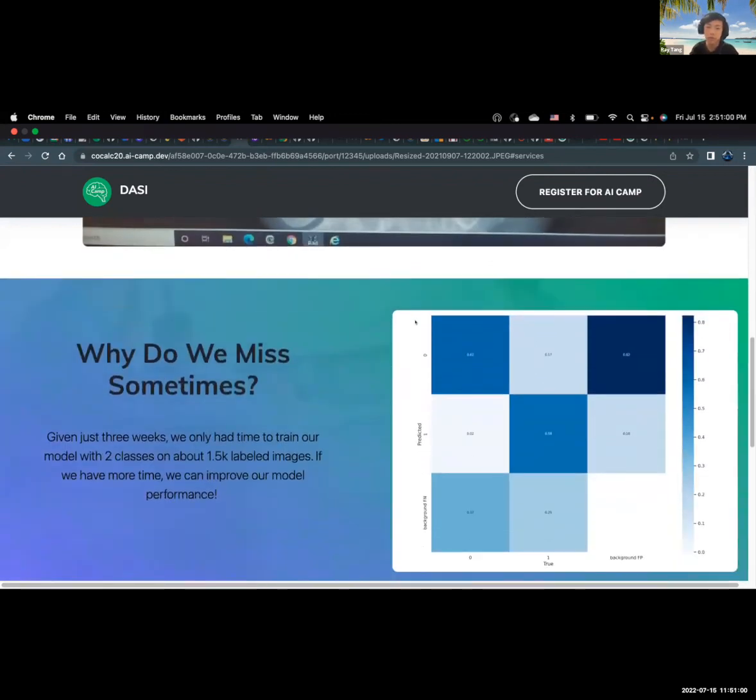I think another improvement that we can make is we could find more ways to augment it, because we only applied some of the augmentation methods. And for each augmentation method, there's an amount that you can augment it. Say it's rotation, you can rotate it a certain amount of degrees. So that basically increases the variety of data. If we were to redo this project, we would aim for a lot more data.